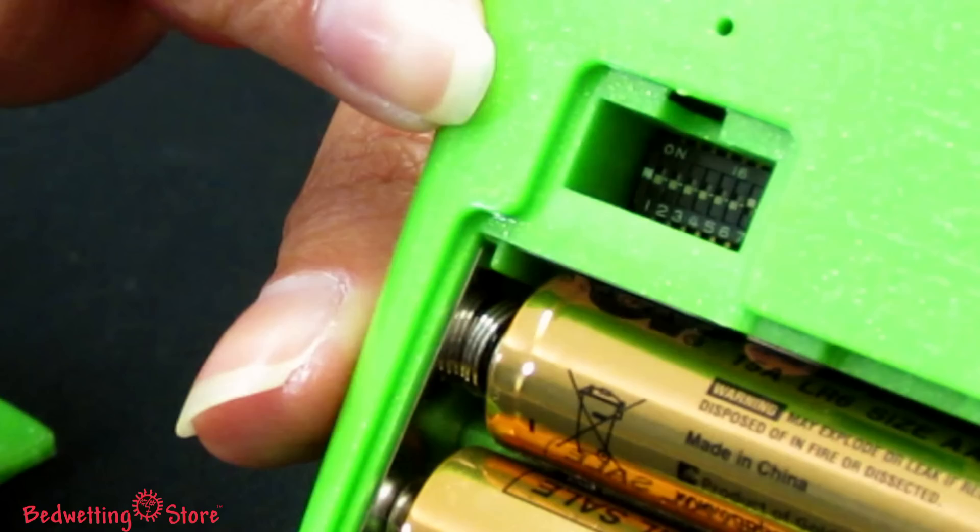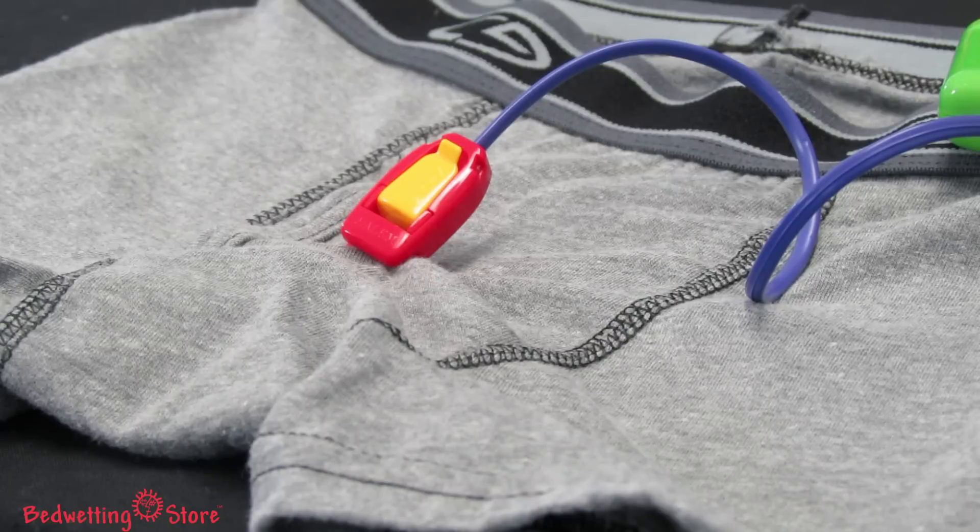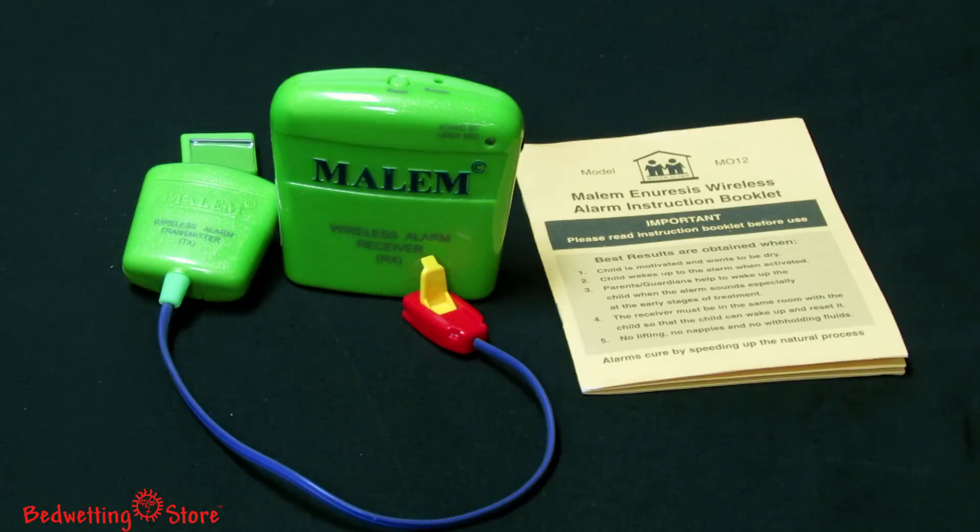Using random tones helps prevent your child from learning to tune out a single alarm sound. When wetness occurs, the waistband transmitter communicates wirelessly with the receiver. The receiver will continue to sound until your child gets out of bed to turn it off, helping him learn to get up in response to wetting the bed.